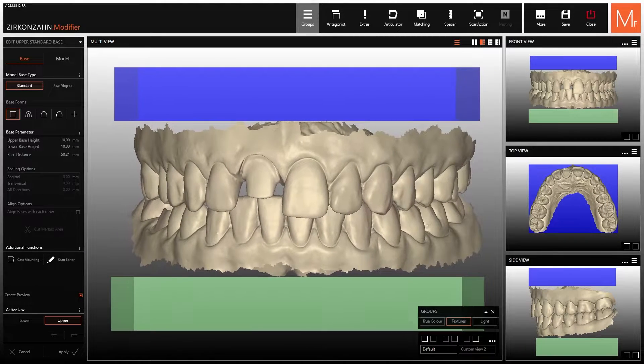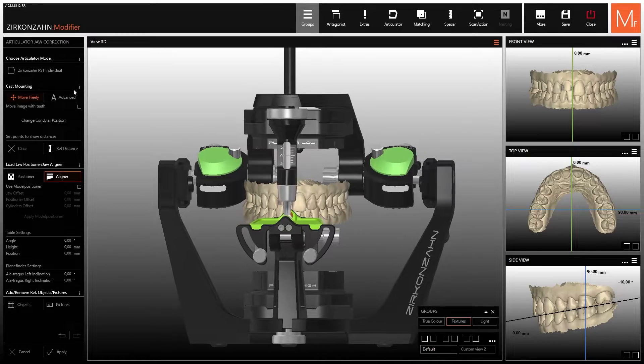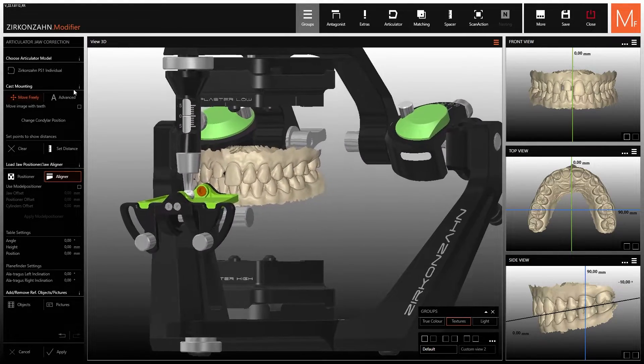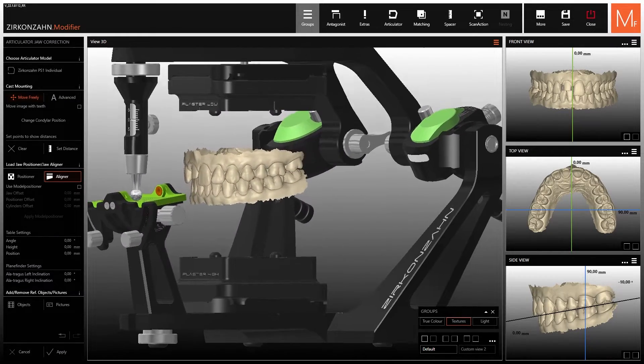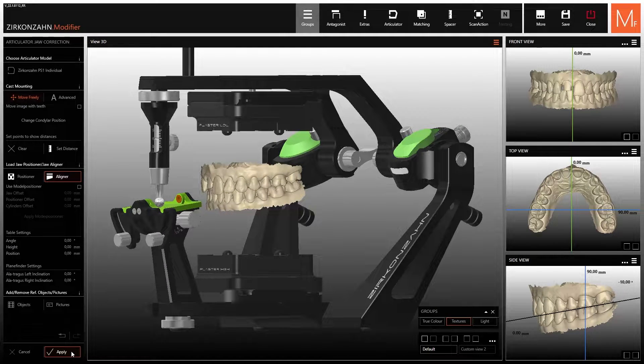This video shows you how to create models with the new jaw aligner system within the model maker module. Select the following button to upload the articulator with magnetic spacer plates. These plates are part of the jaw aligner system and are used to fix the models in the articulator. Once you have clicked on the apply button, you can proceed.